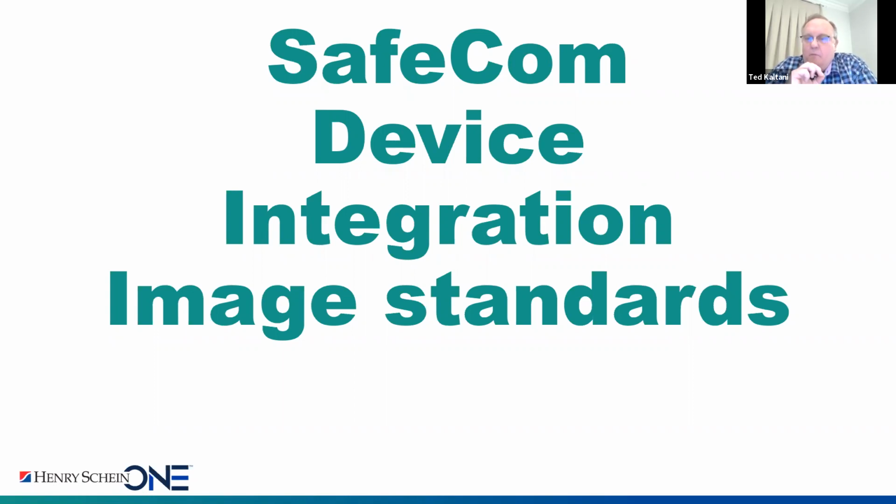APIs are some proprietary piece of software built by specific manufacturers that you can only connect to their devices. What is the problem with an API? An API is proprietary. So if the API is not updated and the customer has software with a lower version, when you buy a new product, even from the same manufacturer, the API that you have may not work, because that's not an imaging standard. It's only proprietary to that particular device manufacturer.